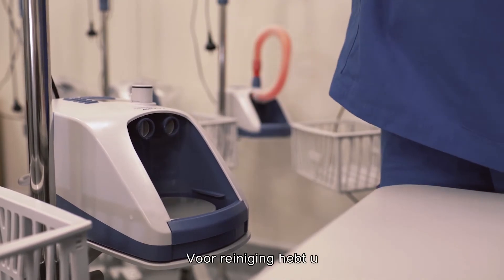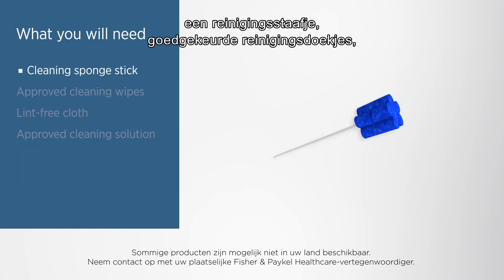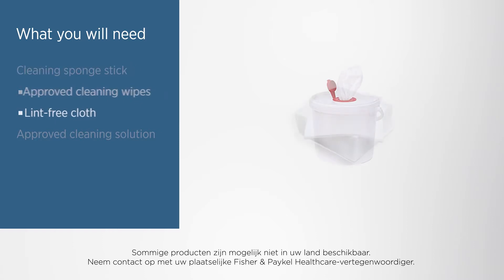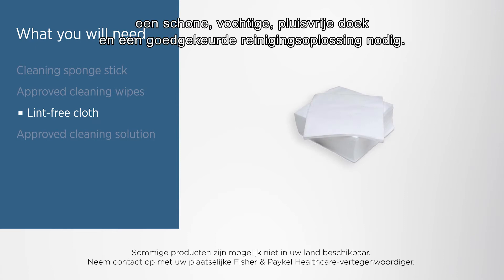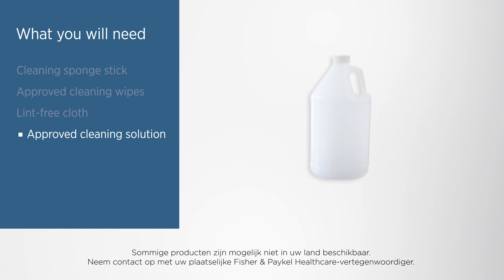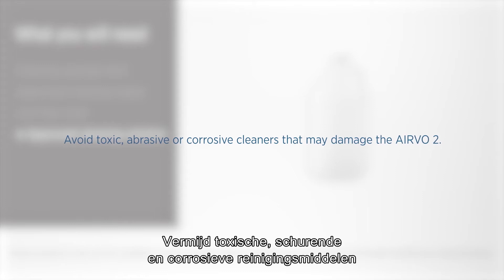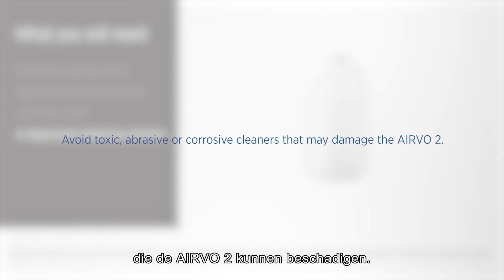For cleaning you will need a cleaning sponge stick, approved cleaning wipes, a clean damp lint-free cloth and an approved cleaning solution. Follow the manufacturer's instructions when using any cleaning solution, diluting it if necessary before use. Avoid toxic, abrasive or corrosive cleaners that may damage the AIRVO 2.